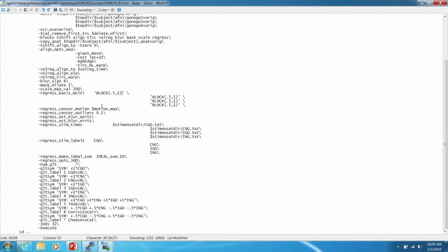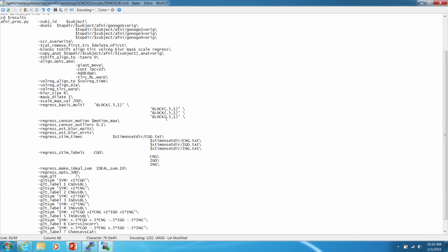This takes that information and convolves it with the hemodynamic response. So depending upon the length, you get this kind of protracted response in oxygenation that happens. And that's how we infer that this change in oxygenation is due to, or is related to, this event that happened in our experiment. I have 4 of these because these correspond to the 4 categories of events that I have in my design.